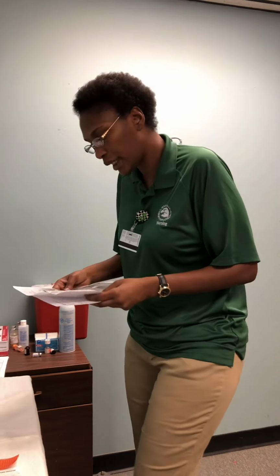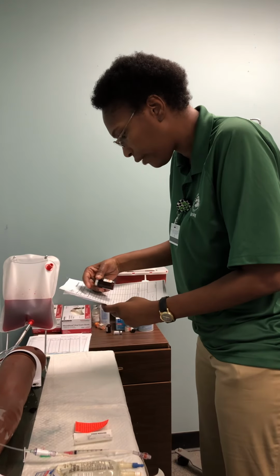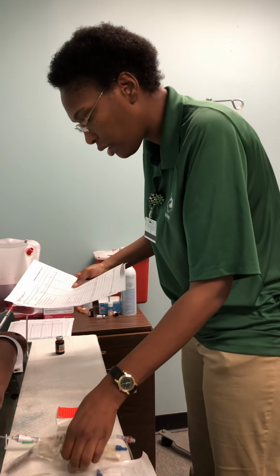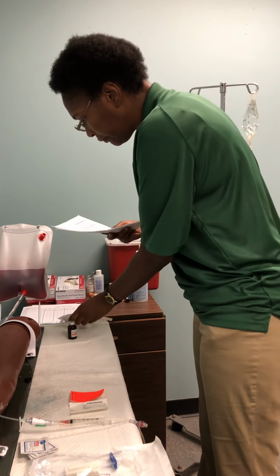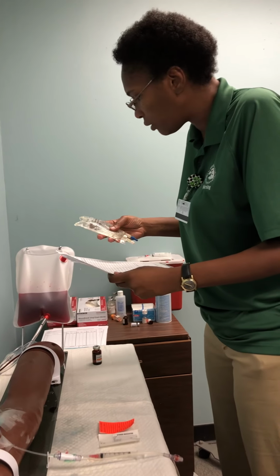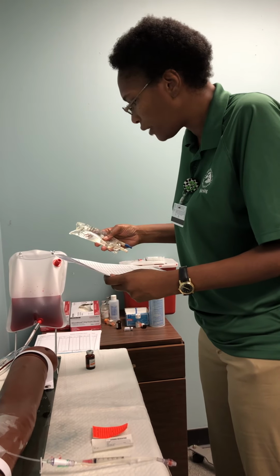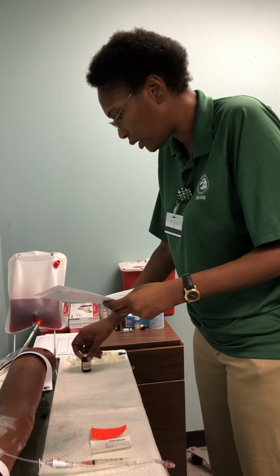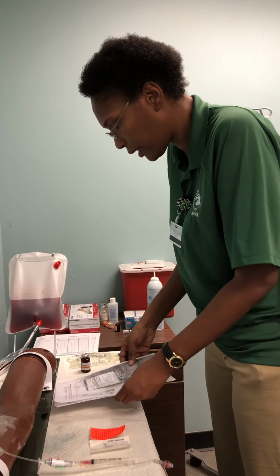Now I'm going to check my medication with the MAR. Furosemide, I have here furosemide on the doctor's orders, 30 milligrams. And my gentamicin, 60 milligrams for IV piggyback. The gentamicin is correctly diluted in 100 mLs of D5W, and the Lasix can be given undiluted. I will wash my hands and prepare my medication.